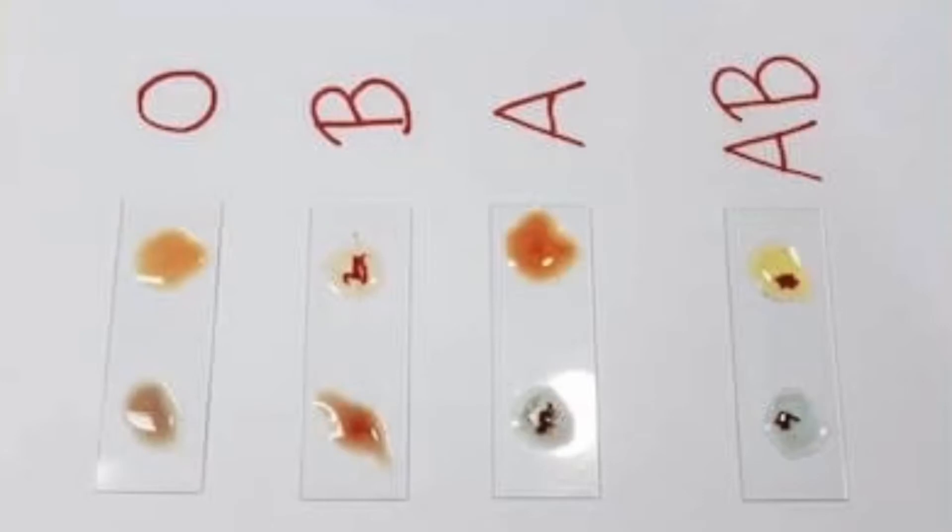The results are read directly from the slide. The subject is blood group A if agglutination occurred with anti-A test serum, group B if agglutination occurred with anti-B test serum, group AB if agglutination occurred with both test sera, and group O if there was no agglutination in either case.